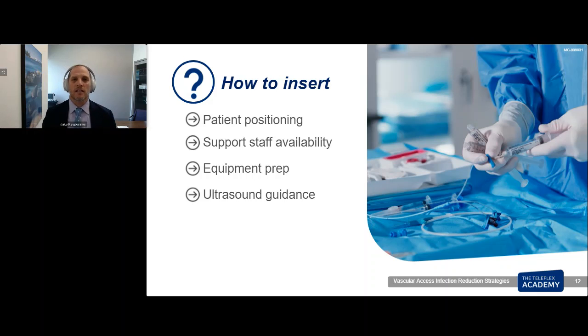But the reality is, most times, an ultrasound machine is available. It will improve the speed of the procedure, it will decrease complications, and it will ultimately lead to better patient outcomes.